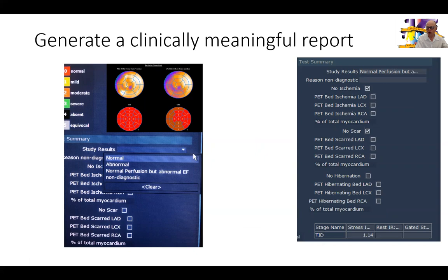This is beyond perfusion abnormalities and beyond ejection fraction. We call it normal perfusion but abnormal ejection fraction. We relied on the stress images to show us that perfusion was normal, but ejection fraction was abnormal. We have fields for results: normal, abnormal, normal perfusion but abnormal EF, and non-diagnostic. We try to keep non-diagnostic below 5%. We are fortunate to have CT attenuation correction for all our SPECT and PET studies. We created that field because we did not want to rely on perfusion alone — we want the EF to contribute to the report.